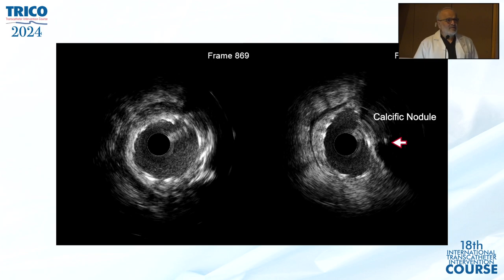It happened. Then I tried with the OCT catheter, it simply did not go. And with the IVUS catheter, I could see a big calcific nodule. It happened because I interpreted OCT very hurriedly, which I should not have done. It was limited time with me, but anyway, if you are doing imaging, don't be in a hurry to interpret. Always take your time and interpret.